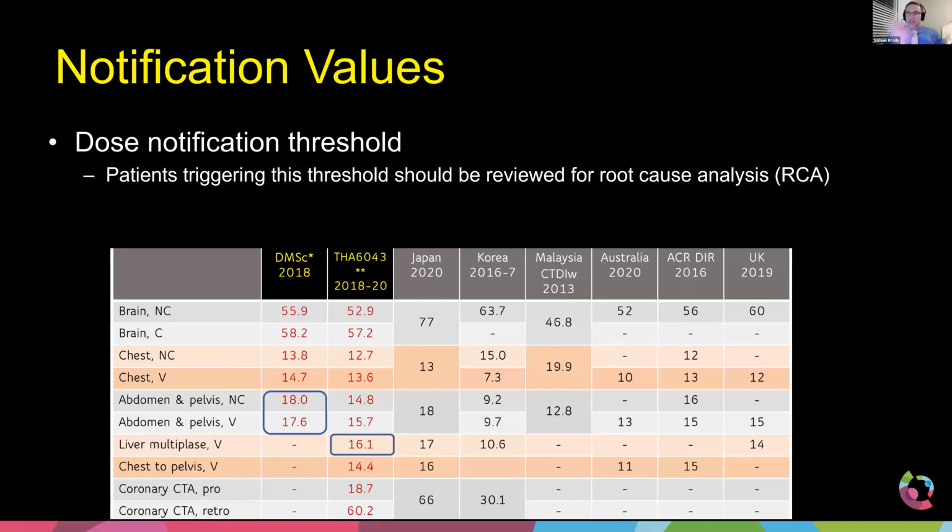And then obviously, as Dr. Panyatai mentioned, having doctors there observing, that's pretty common. Radiologists working closely with cardiologists actually at the scanner. And those are really great ways to keep your doses down too. And then using the best technology you have at the time. So obviously using iterative reconstruction, if you have deep learning, that's another great way to reduce your doses.